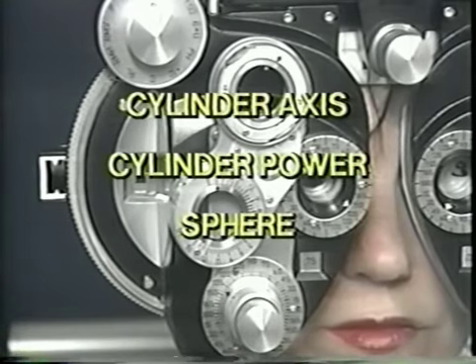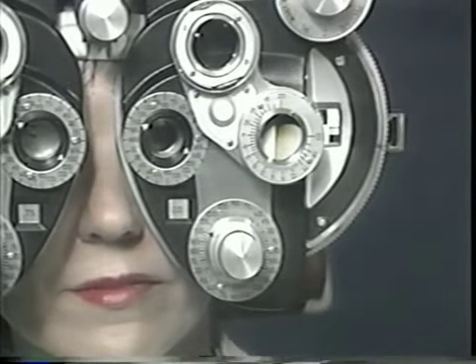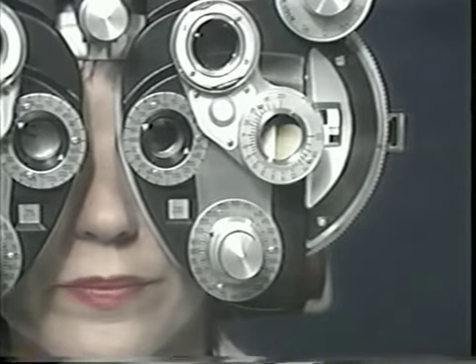Let's follow the refraction of the left eye without interruption. Okay, let's go over to the left eye. Look at the chart now. How far down on the chart can you read? OFLCT. Any further?